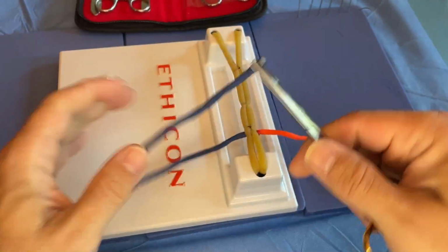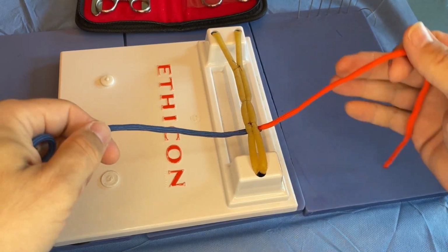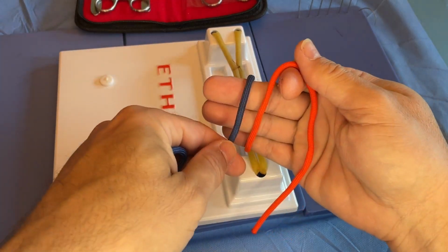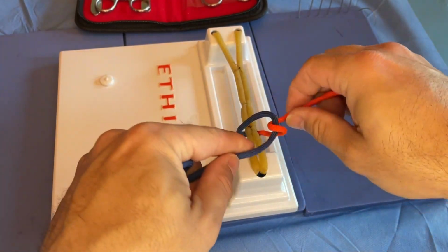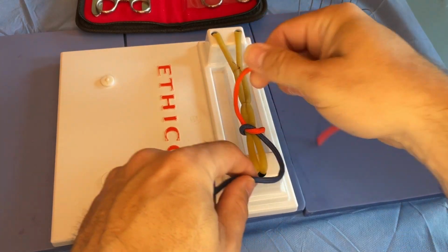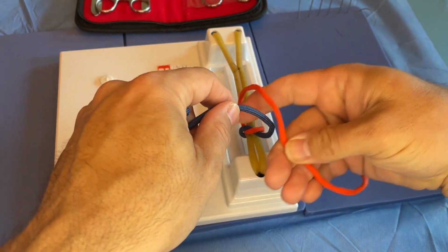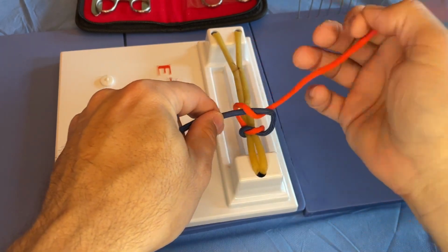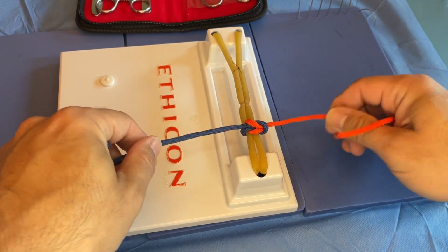Anyway, let's say we've got our needle here, so we've driven the needle through the tissue, I hang on to it here, and then for the 1-handed throw, I start off over the fingers. So again, we're creating the same loop in the suture, and then pulling it through. Here, I cross over this way, so you can see that's laying it down nicely. And then when we come back, it's over just our index finger. So again, we're creating a loop, putting our finger through, trapping the suture, pulling it through like that. And there's our nice square knot, 2 throws, 1 complete square knot.